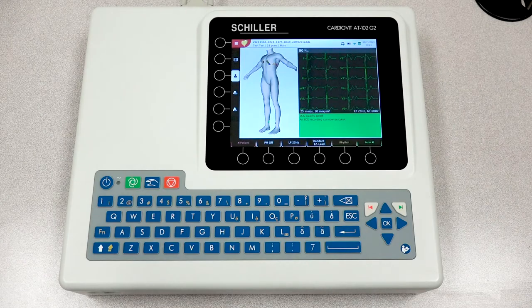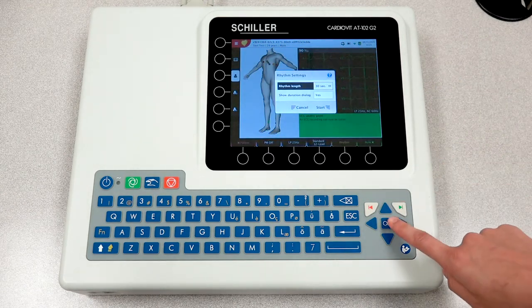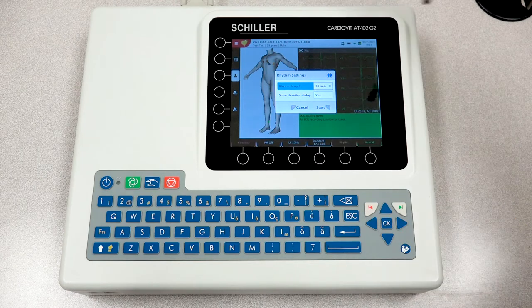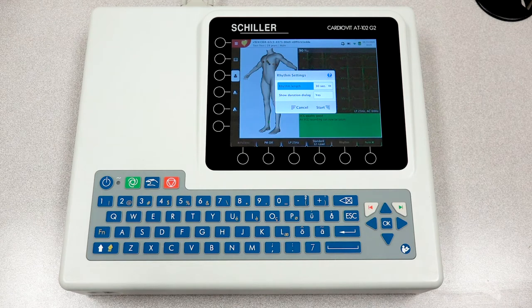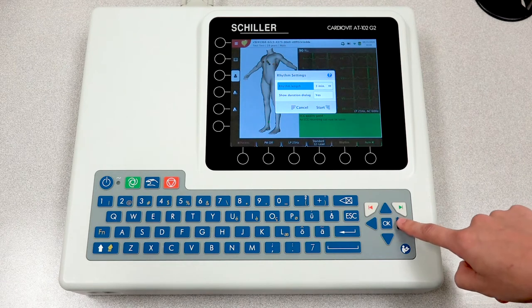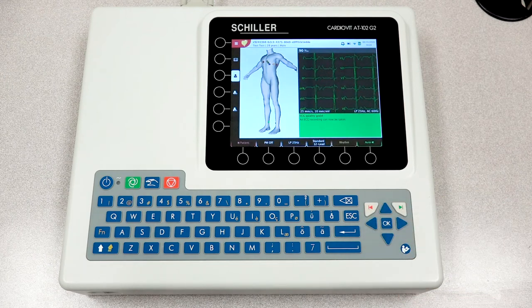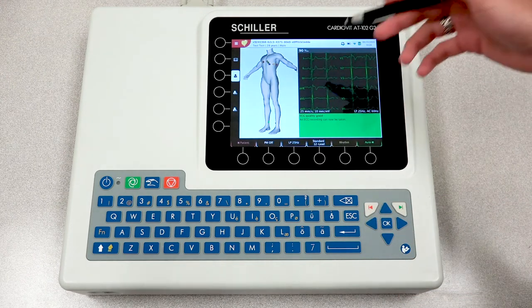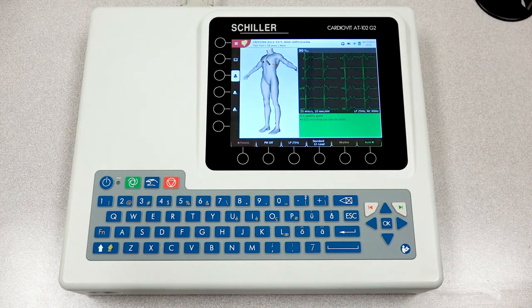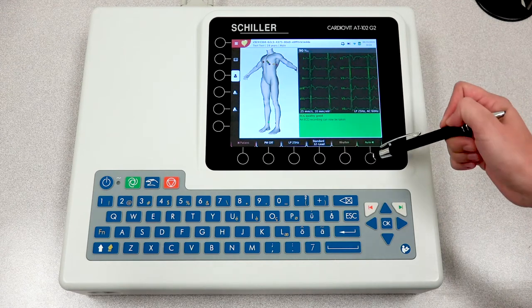You also have the ability to perform a resting rhythm ECG. Please be sure to press OK to highlight the field in blue, now providing you the option to select. A resting rhythm ECG has the ability to perform a minimum of 30 seconds to a 4 minute resting rhythm ECG. If the signal quality is good, you can move forward to performing your resting ECG by selecting auto.